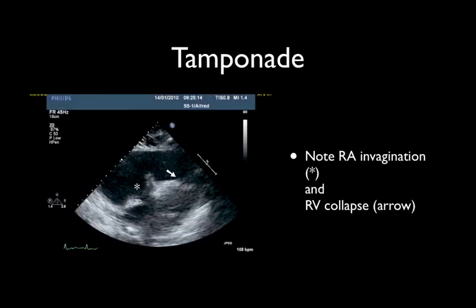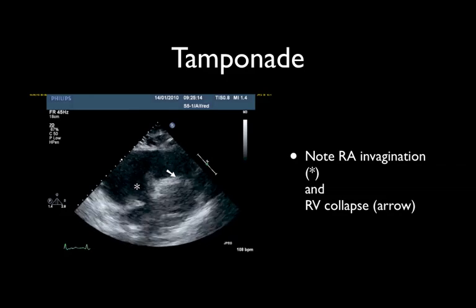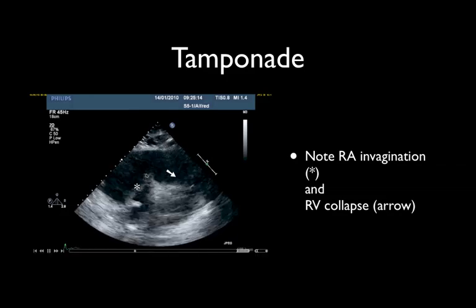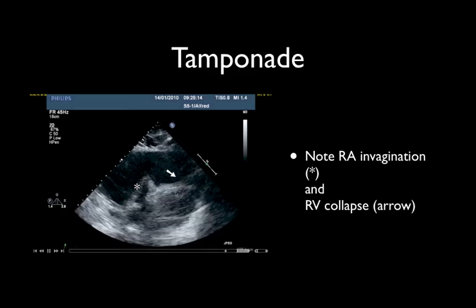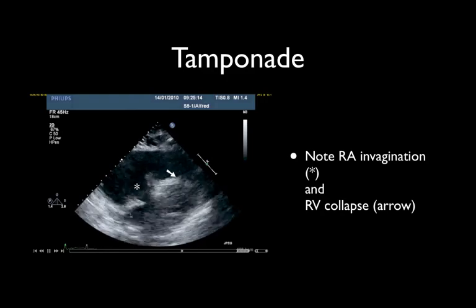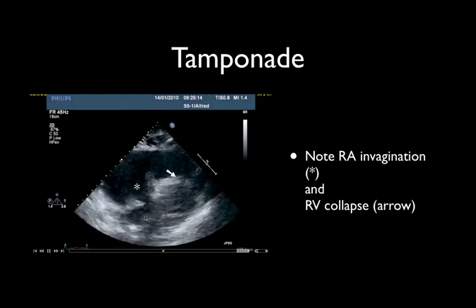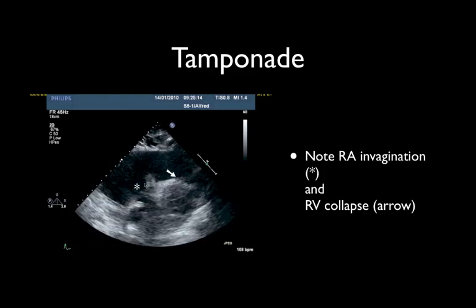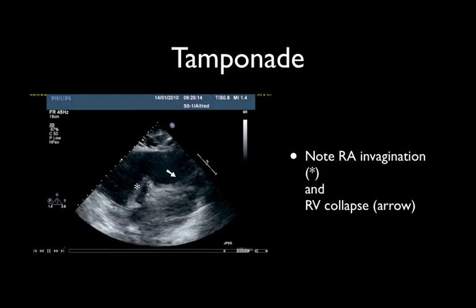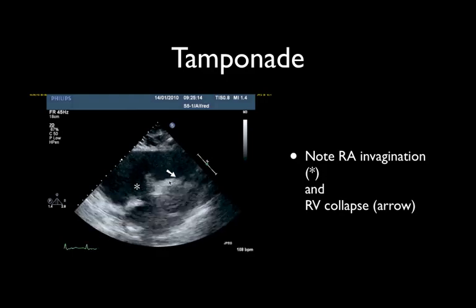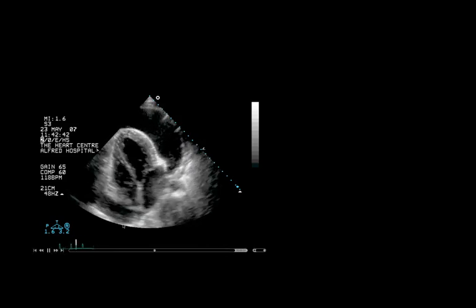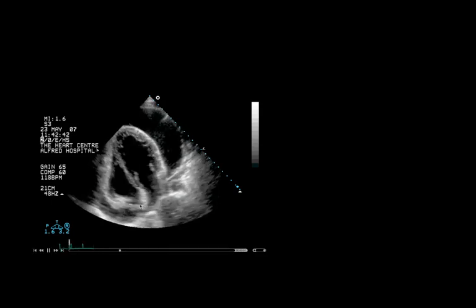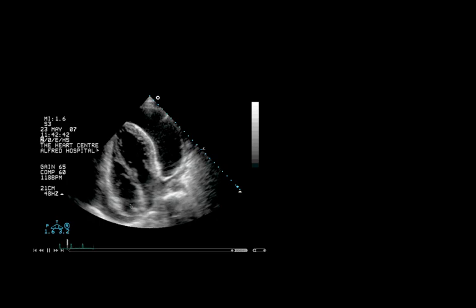Here is an example of a patient with tamponade. This is a subcostal four-chamber view showing pericardial effusion. The left ventricle and left atrium are visible, but it's almost impossible to see the right-sided structures — this is the invaginated right atrial wall and here is the right ventricular wall. In this apical four-chamber view, the striking abnormality is the dynamic invagination of the right atrial wall.